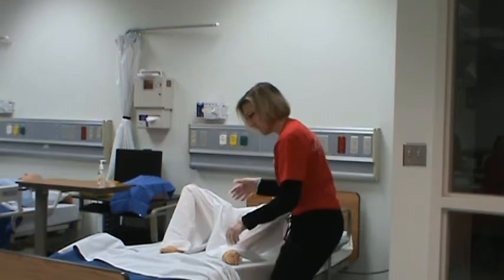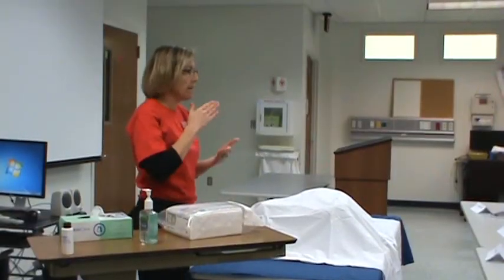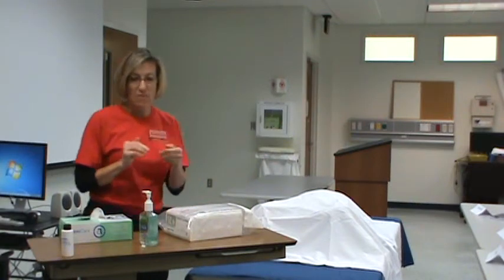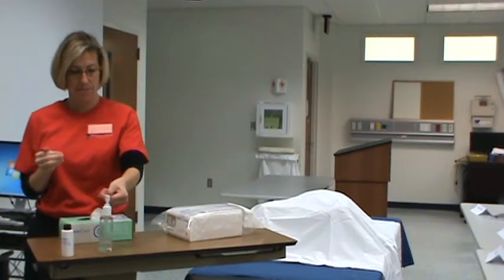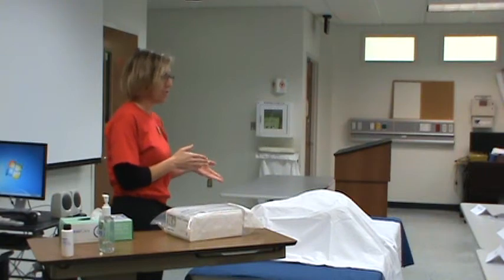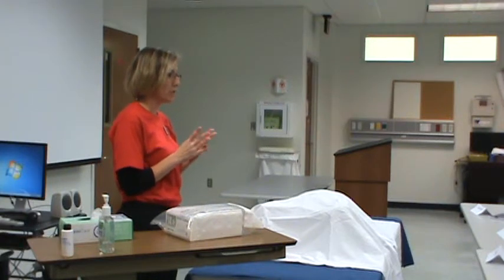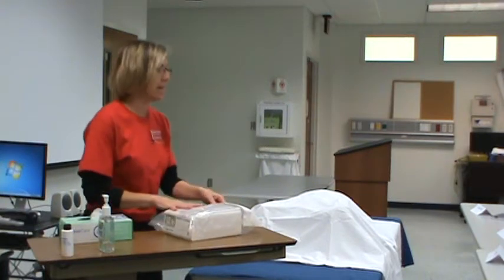So I set him up over here so you can see. We've already done the two-patient identifier, and this is going to be Mrs. Smith this time. I've performed my hand hygiene and introduced myself to Mrs. Smith. And then the very next thing you want to ask her is, in regards to allergies? Yes, allergies. Very important. This is a latex kit.